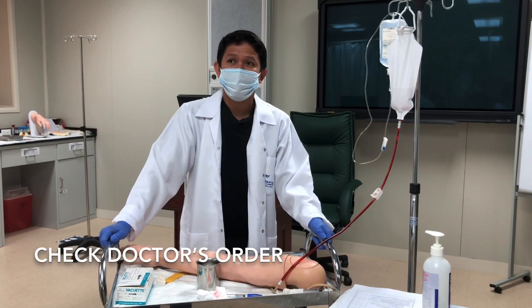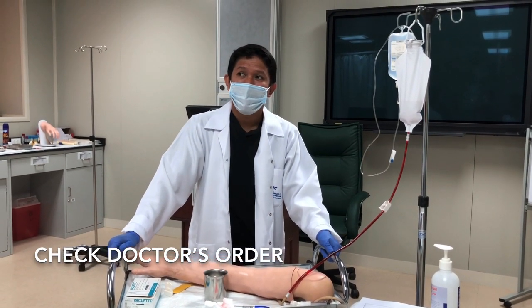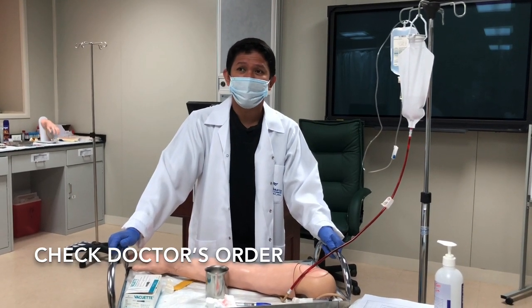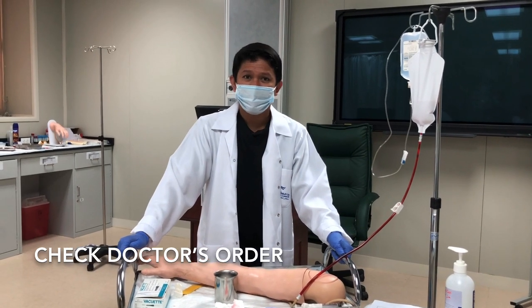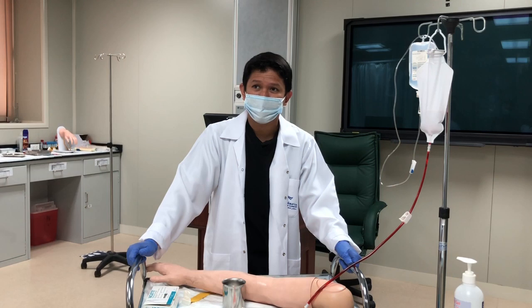The first thing that you need to do is to check the physician order. This is very important because the procedure requires a doctor's order. It is a dependent nursing action. Without a doctor's order, we cannot proceed. Even a verbal order from the doctor is good enough for us to start the IV cannulation.